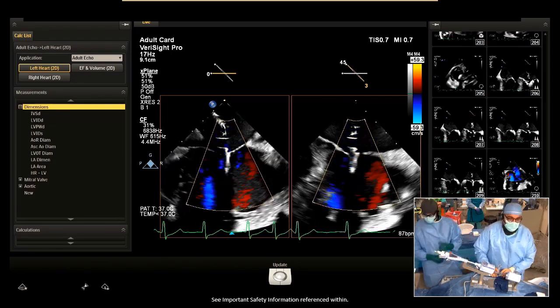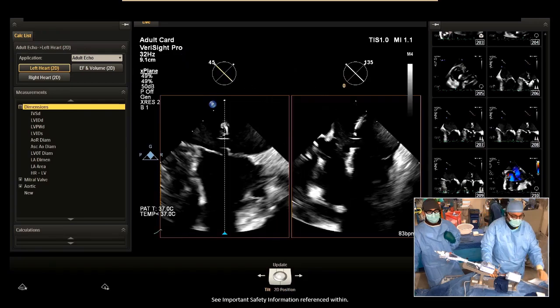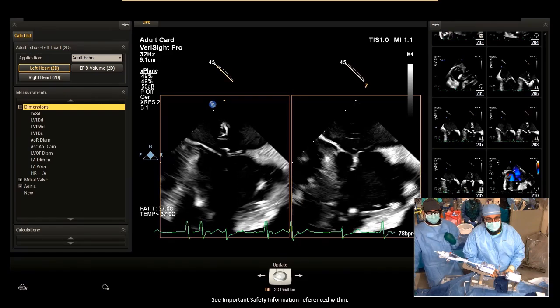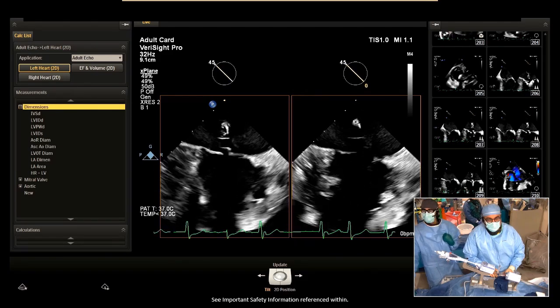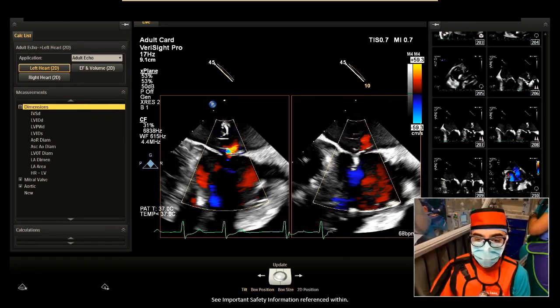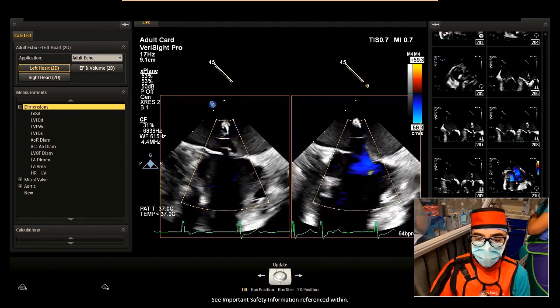I'm going to go back to 45 tilt elevation, Gagan, just to reassess really quickly. Okay. Tilt elevation is active at 45. I'm rotating slowly. Looks like everything has stayed the same. Yeah, it looks good. I'm going to put color on as well and rotate. So now I'm just rotating through at 45 degrees on either side of the clip and just looking.